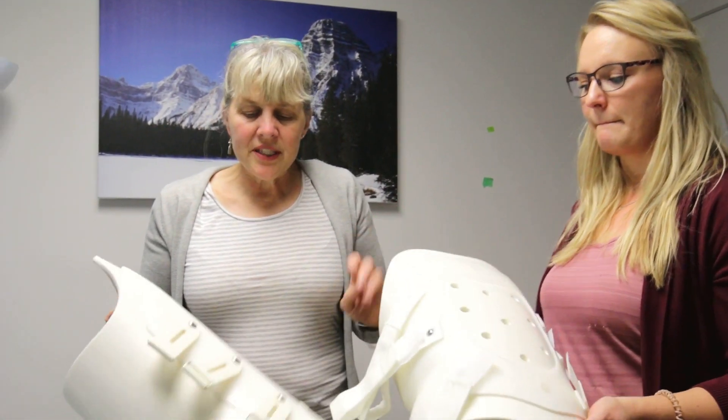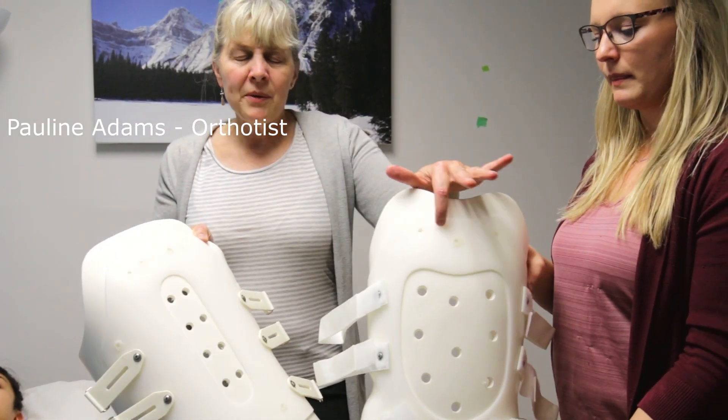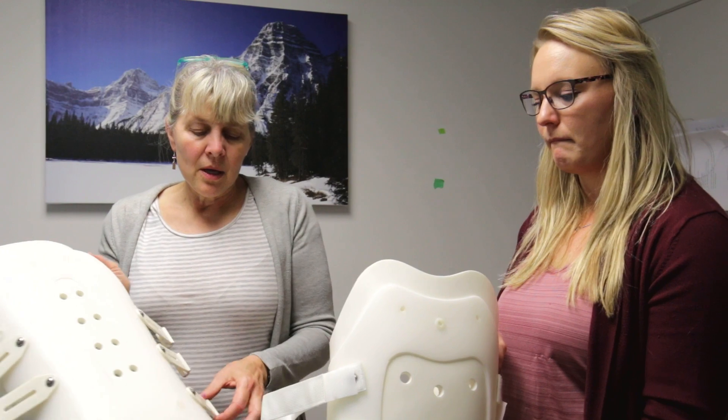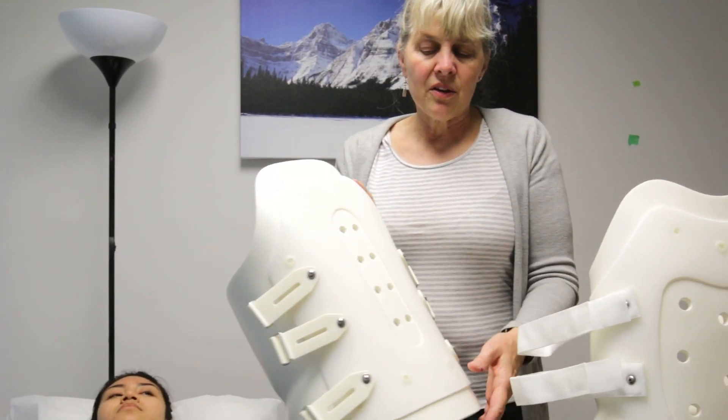It comes in two sections — there is a back and a front, sometimes hard to differentiate, but it will be labeled once you leave the hospital with front, back, top, and bottom, because that seems to be the most common problem. The back always has the D-loops or the harder plastic part, so that's one way to tell the difference.